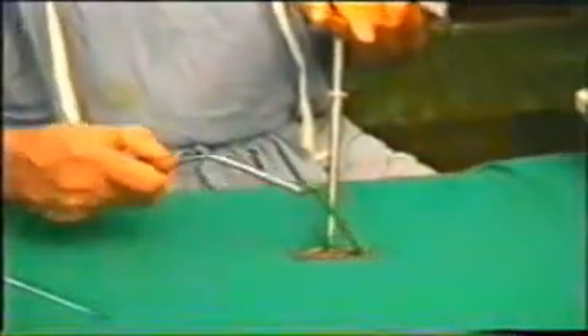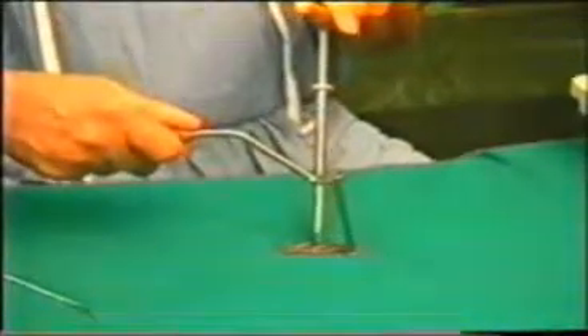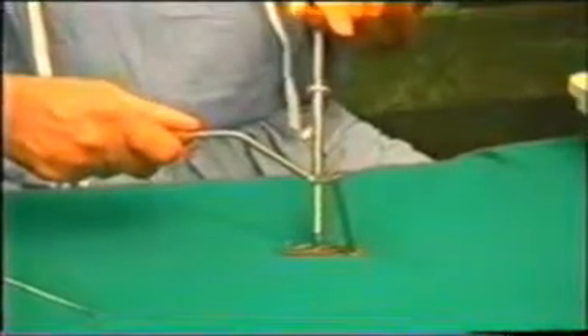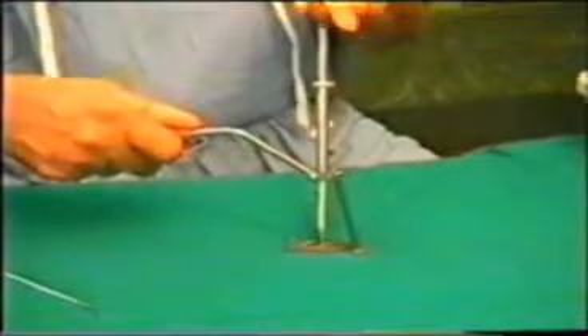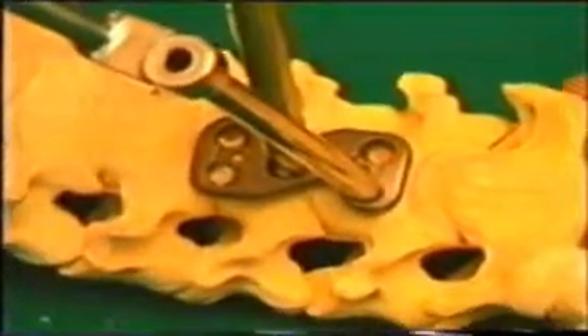This is the guide. Once it fits in the correct position it is also at an angle of 15 degrees. If it is not at that angle, it does not fix — it just comes out. The guide is fixed in position, and this is the drill, which will go through the guide and drill into the bone.